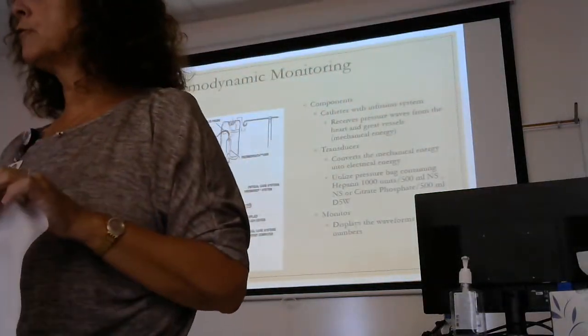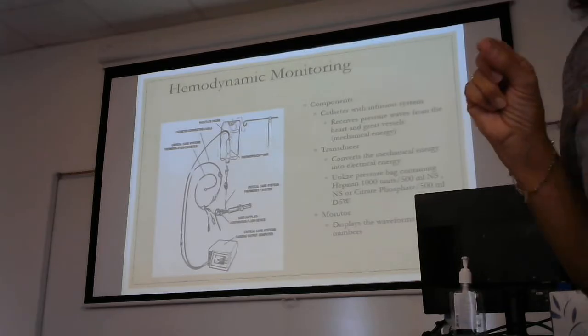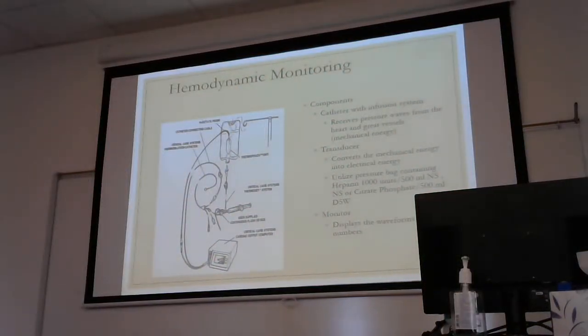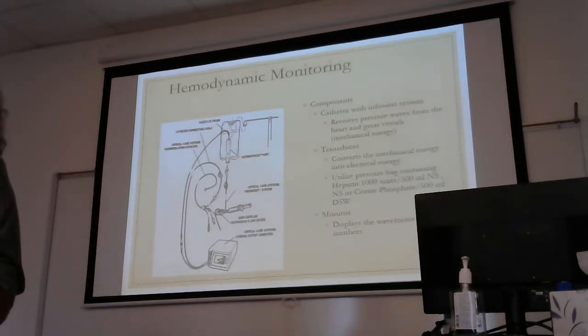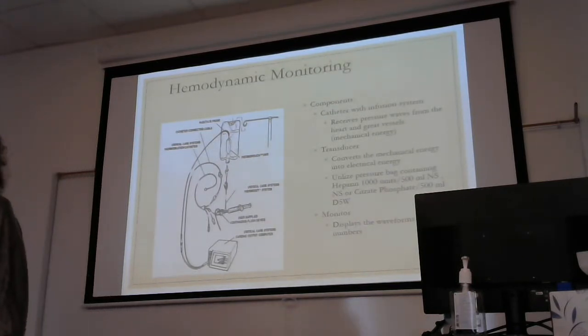It can consist of 3 different options. Citrate, which I have not seen in a long time, straight up normal saline, and then a very dilute heparin premix. Now this heparin is not something we can use for an IV infusion, not transfusion, because it's way too dilute. It's only 1,000 units in 500 mils. That's not going to anticoagulate anybody. Okay, a standard heparin drip is 25,000 units in 500. So you can see a big difference there. But they'll put that fluid in here, and usually it depends on what we have available. That's what determines what we put here, okay?